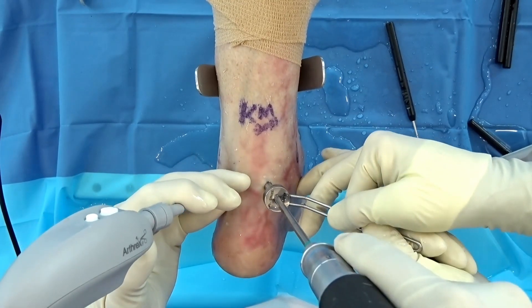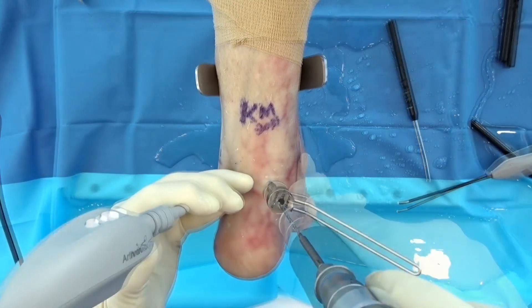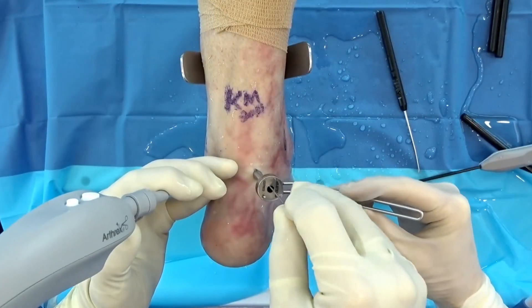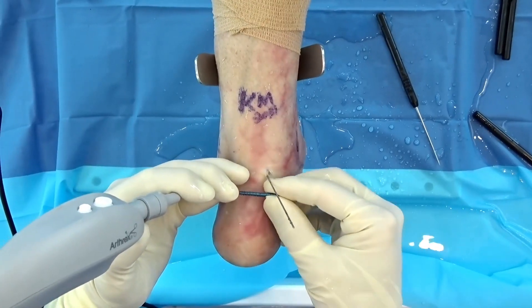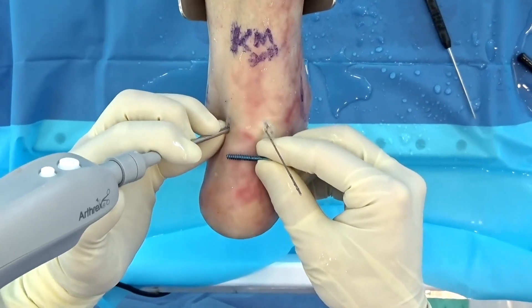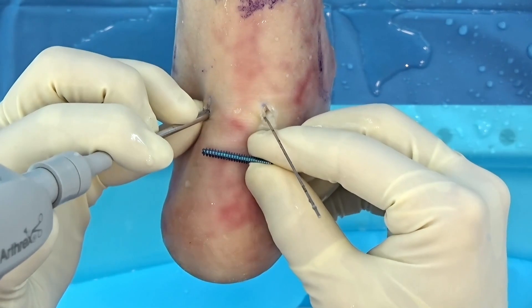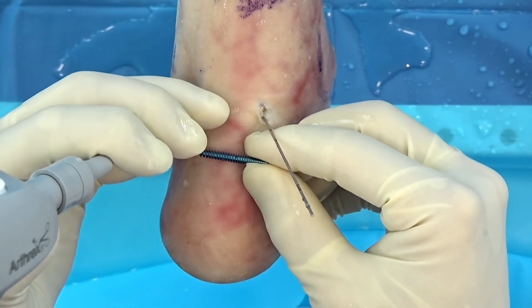Soft tissue guide down. This is the countersink — we're going to countersink, pull that out, then drill. You can imagine our talus fracture: we come up here, visualize it, make sure it's reduced, come back down. Now we have the screws. This right here is a Comp FT 3.5 millimeter. Why I use this screw for posterior malleolus: it's cannulated so I can do it through the scope; it's titanium so if I need a post-operative MRI I get less scatter — that's a Thorntzen paper.